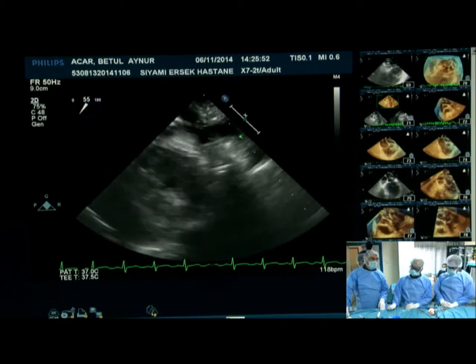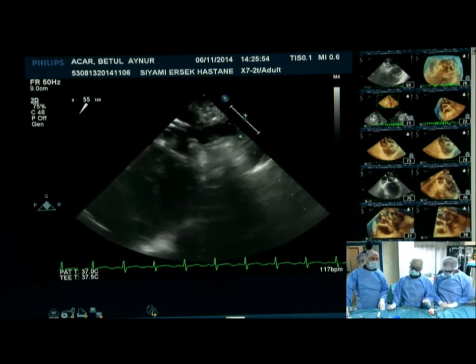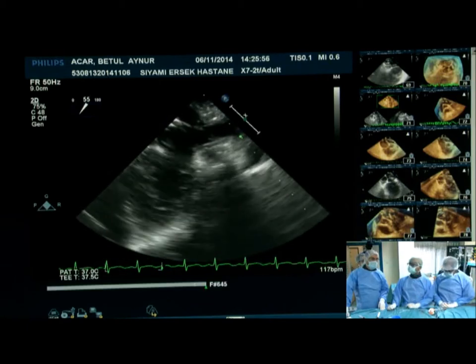Yeah, cribriform would be reasonable, but remember the biggest defect here is 15 millimeters, so it just allows the device to perhaps move up and down in the defect and then slip into the aneurysm a little bit as well. Shak, may I make a comment on this?